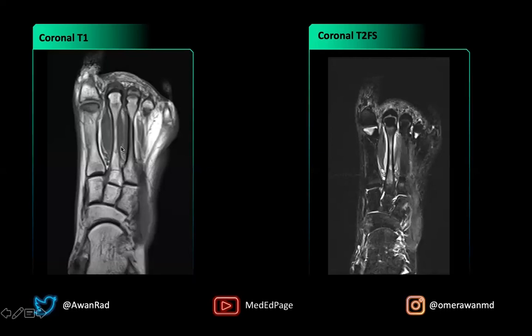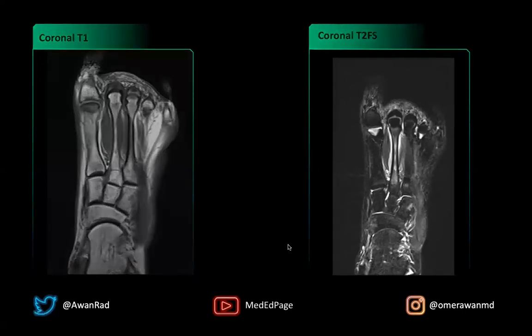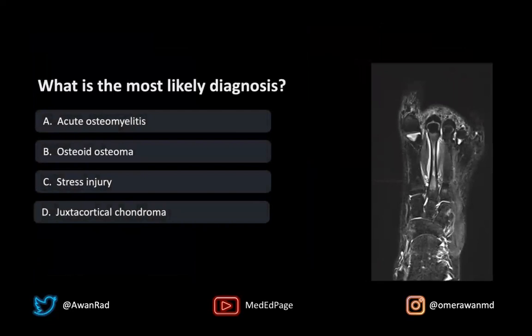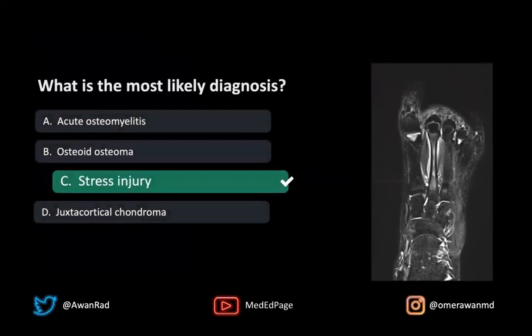The best answer here is a stress injury to the bone, where you have marrow edema, subperiosteal edema, and only faint changes on T1 in the second metatarsal shaft. So the best answer is going to be C — a stress-related injury.